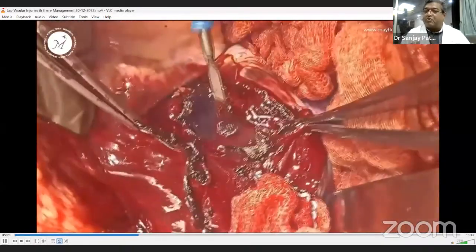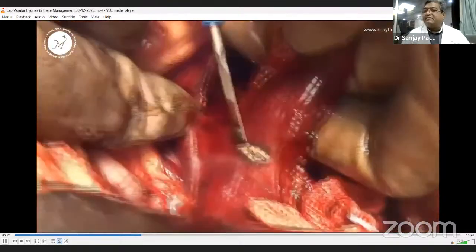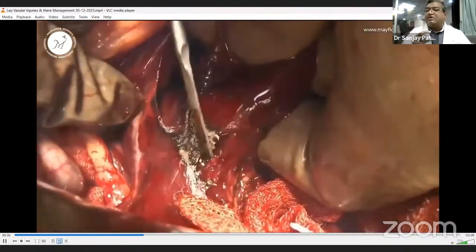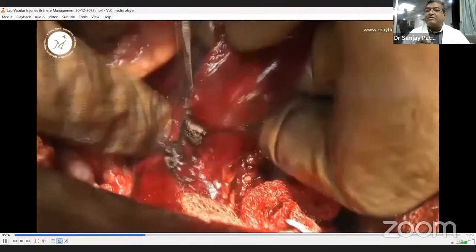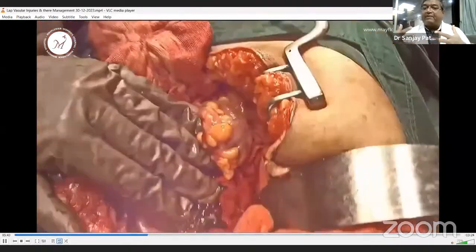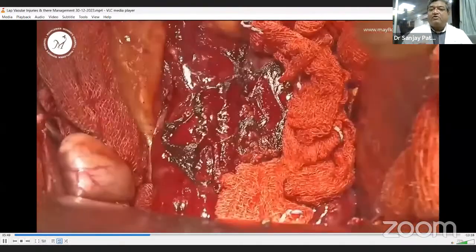We dissect the hematoma further and we excise it. You look, it's more than 1.5 inches in size. So we properly excise the hematoma. And we realize that due to this pressure effect and this fibrofatty tissue, it is different over the aorta, it's stony hard.